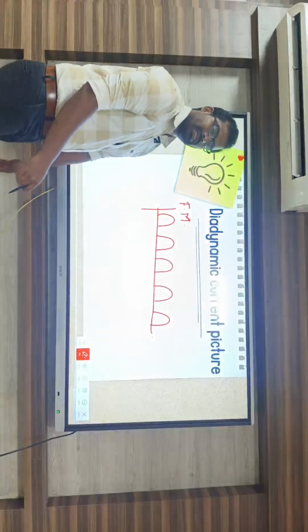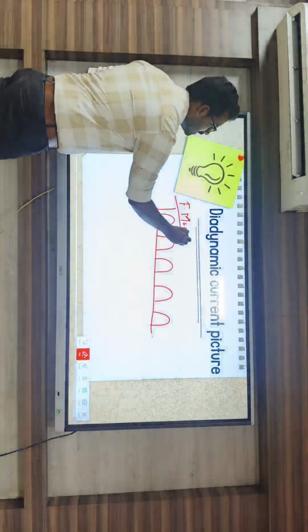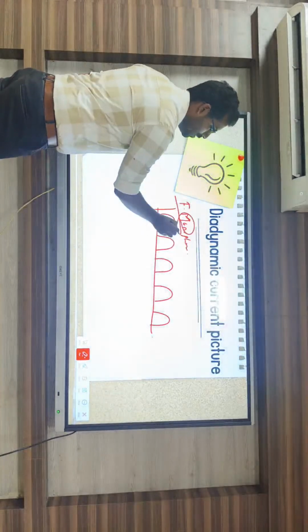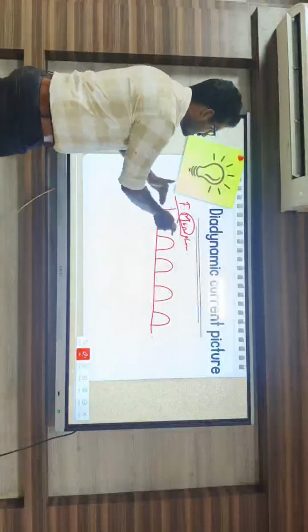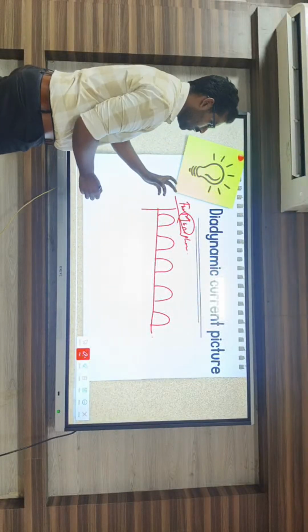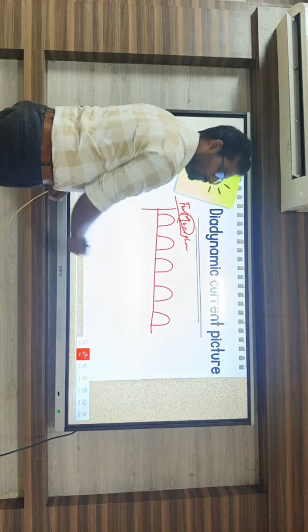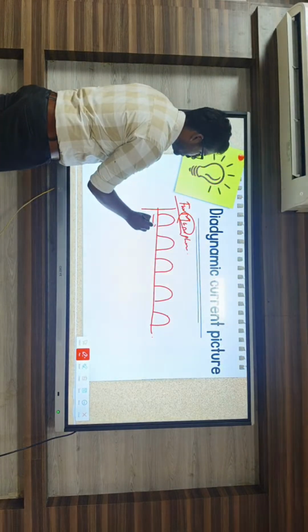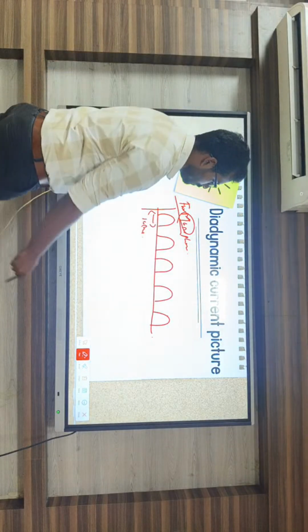So this is the schematic picture for the fixed monophase. The name itself mentions mono, right? So mono means only one direction of current, which is presented at the frequency level. For this fixed one, the frequency level is going to be fixed at the peak level, which depends on the person, and the pulse duration is 10 milliseconds. So that is the fixed monophasic current.